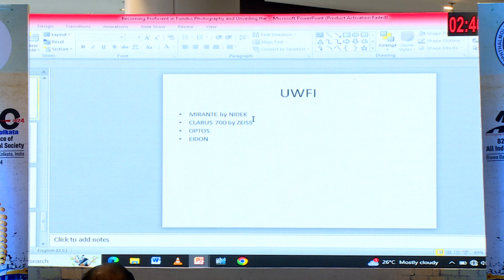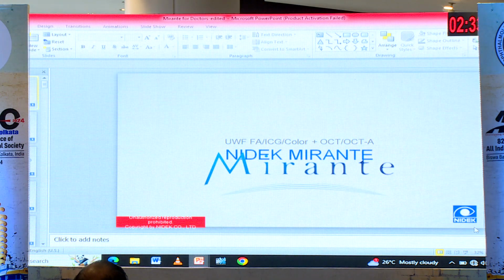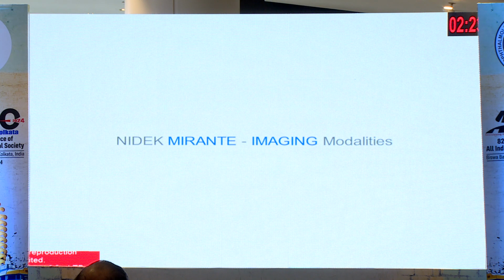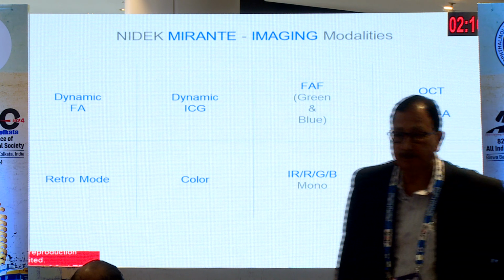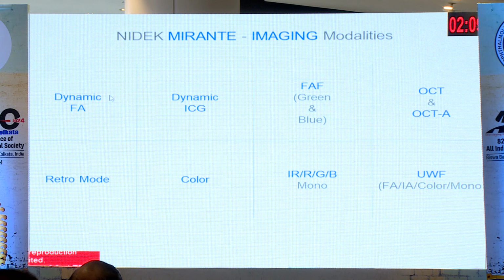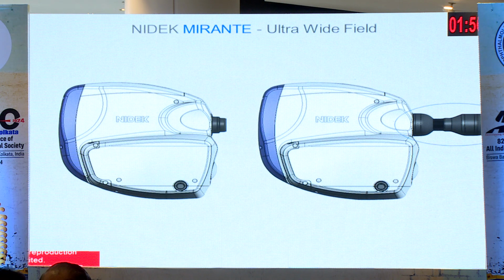A little about these. I am using Mirante, and it has this wide field capability. It has the normal color images, the ultra wide field, and monochromatic imaging as well. Then it has dynamic FA, ICG, and fundus autofluorescence, and a new retro mode, and then OCT and Octa as well. It has this ultra wide field attachment here.